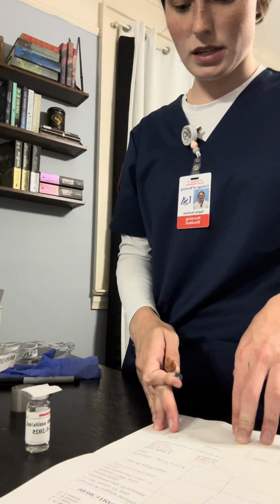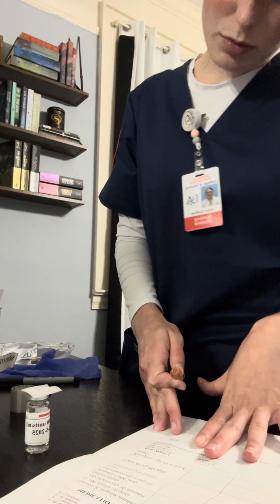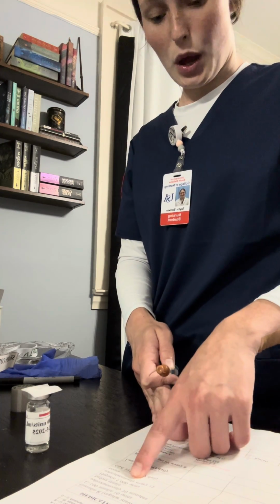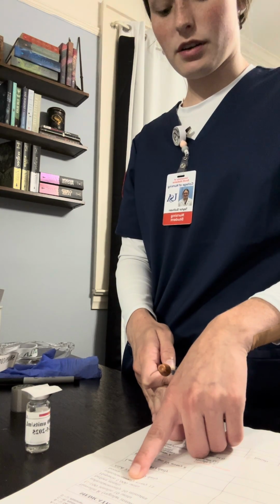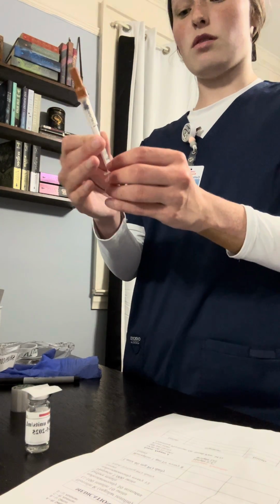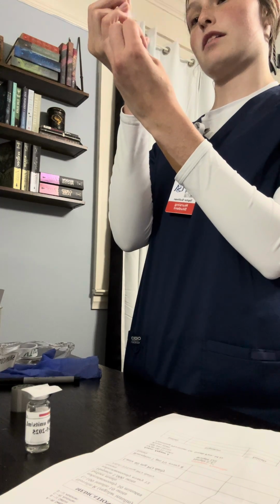Okay, so heparin is 10,000 units per milliliter. I have an order for 5,000 units, so 10,000, 5,000. That is half. So it is per milliliter, so that'd be half a milliliter. So it'd be 0.5 milliliters of heparin that I would be drawing up. So I'm just going to draw up air first to 0.5.